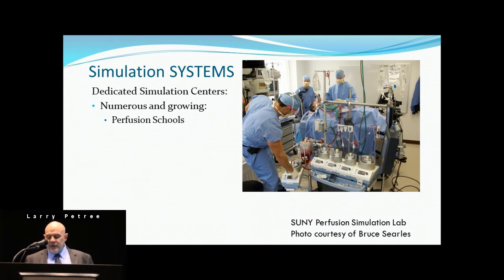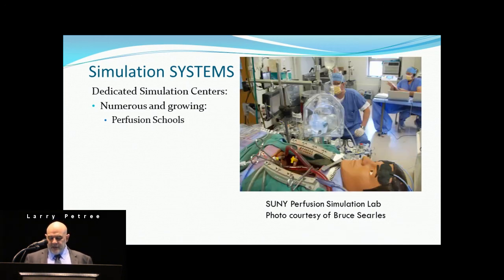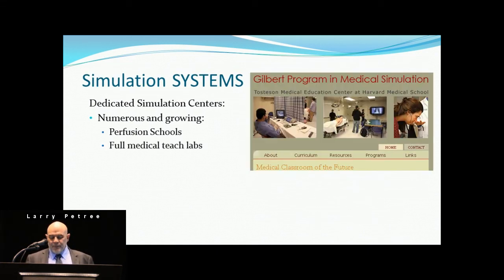Another one is at SUNY. These pictures were sent in by Bruce Searles, who also helped me prepare the survey. Very active program. They use a blood analog here, or sometimes bovine blood, and the perfusion students get a very realistic experience. This is another picture of the mannequin that they have up at SUNY.